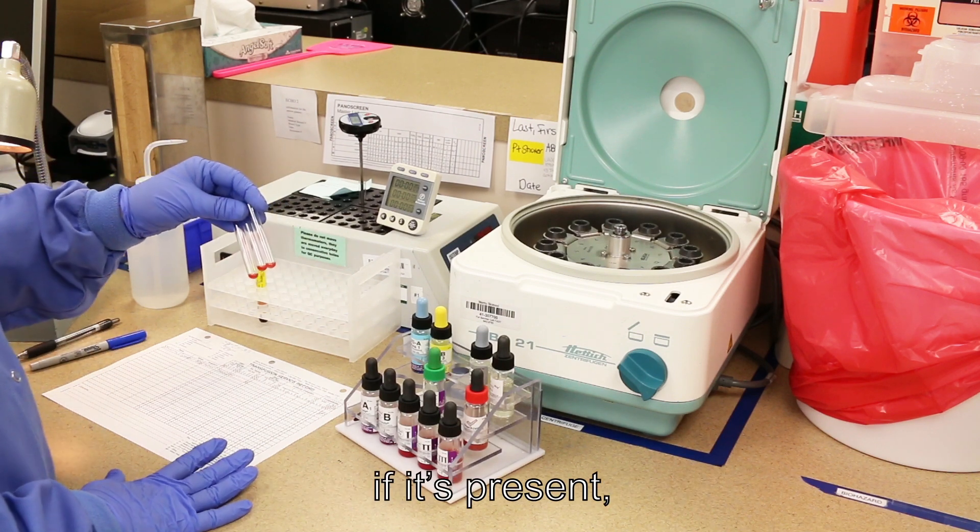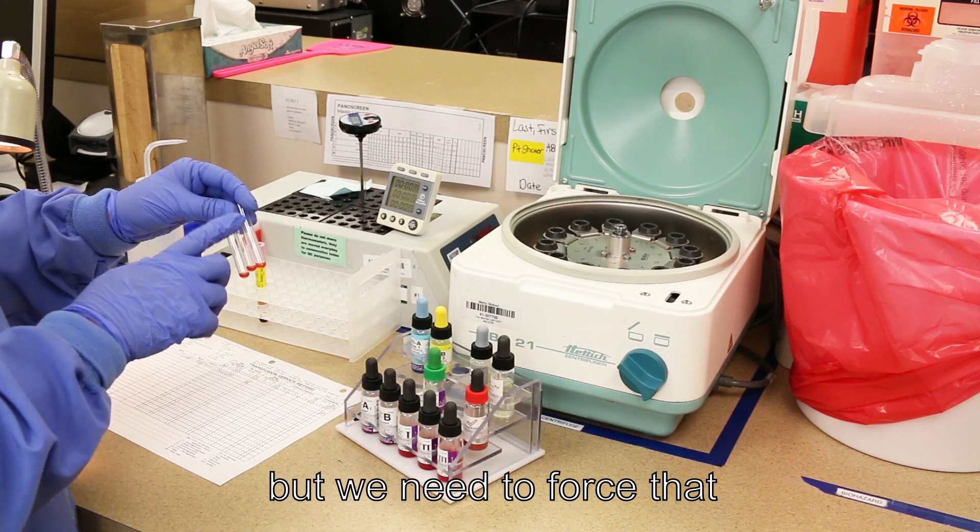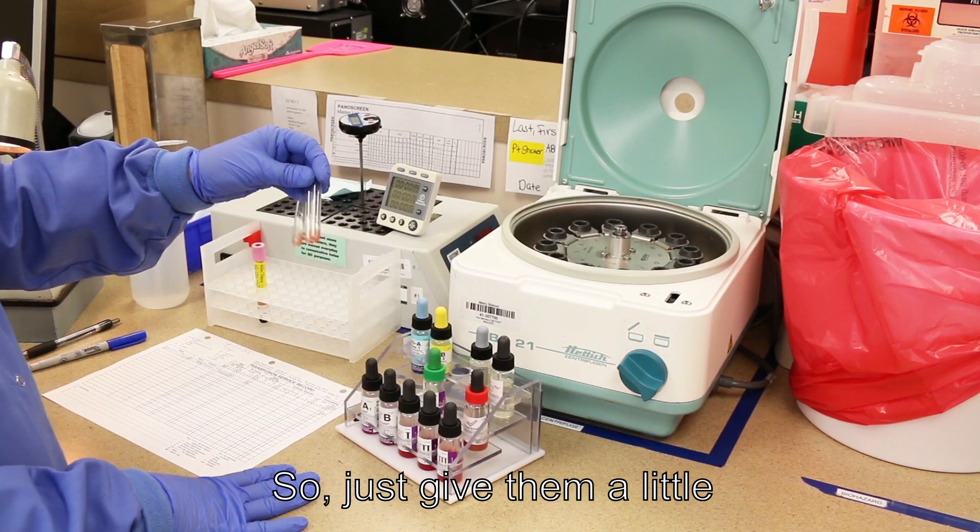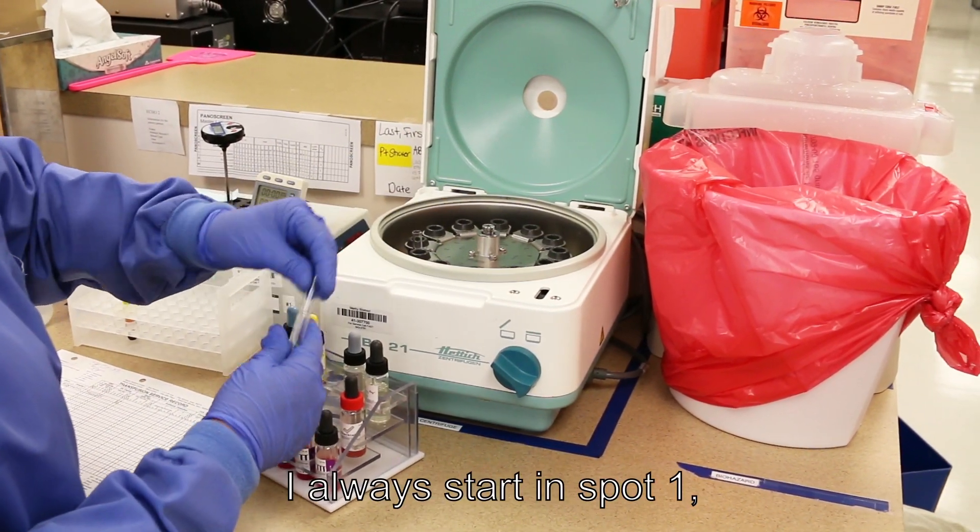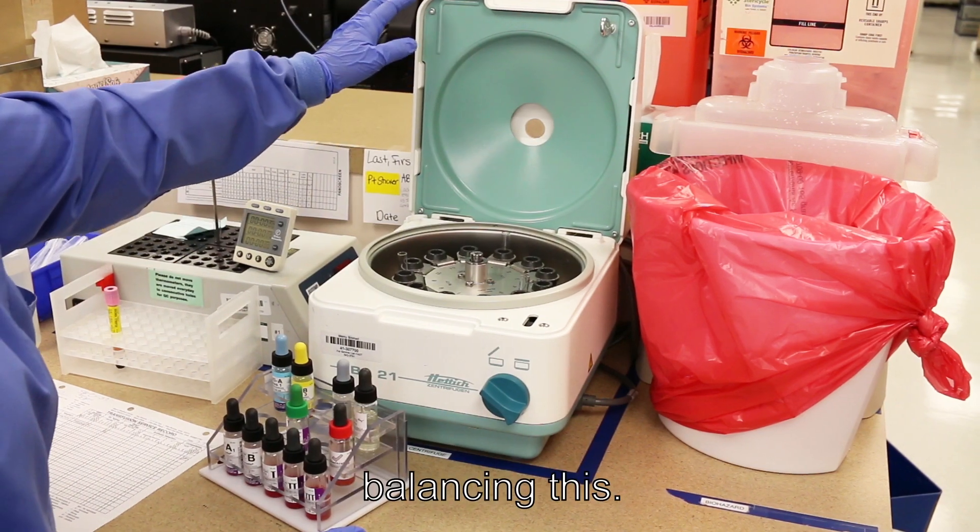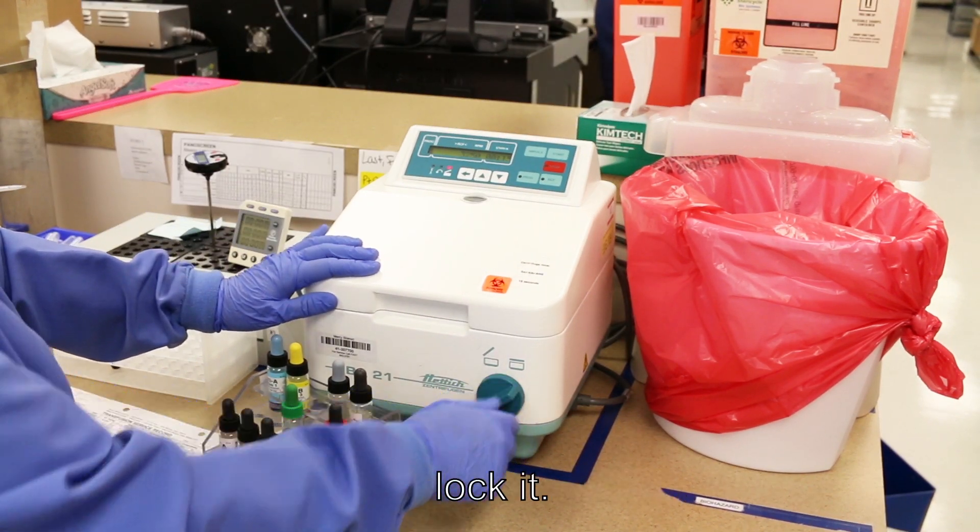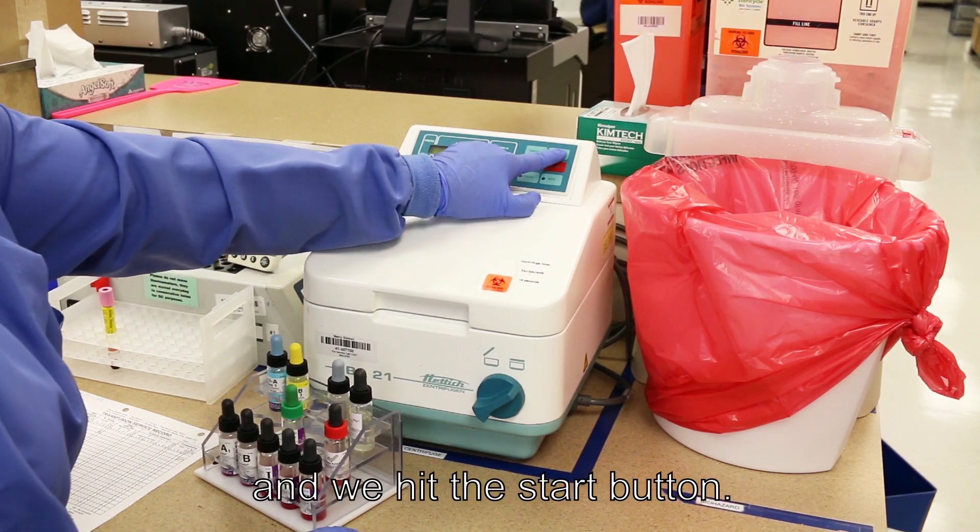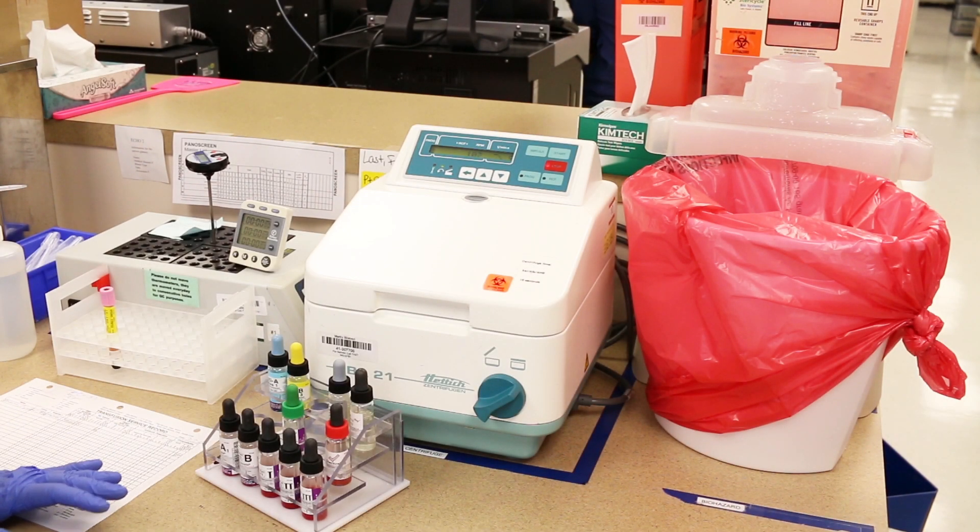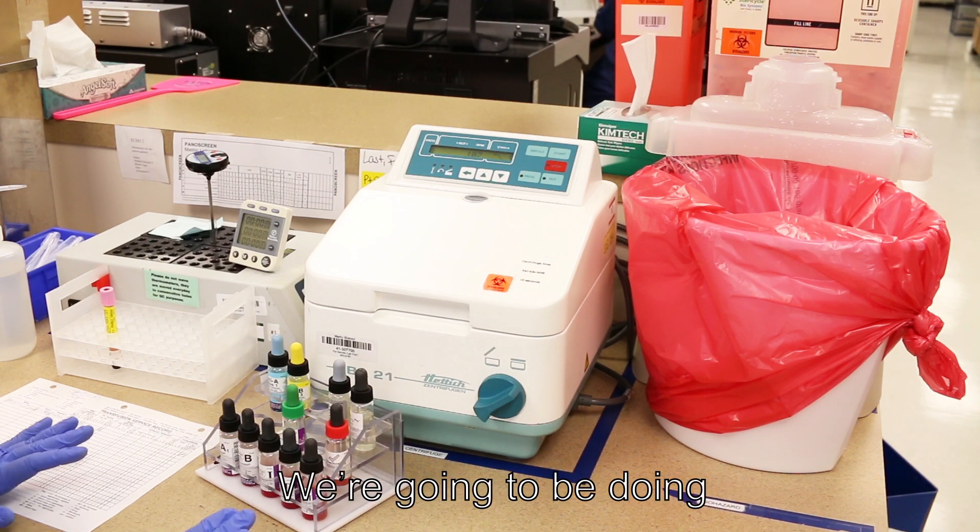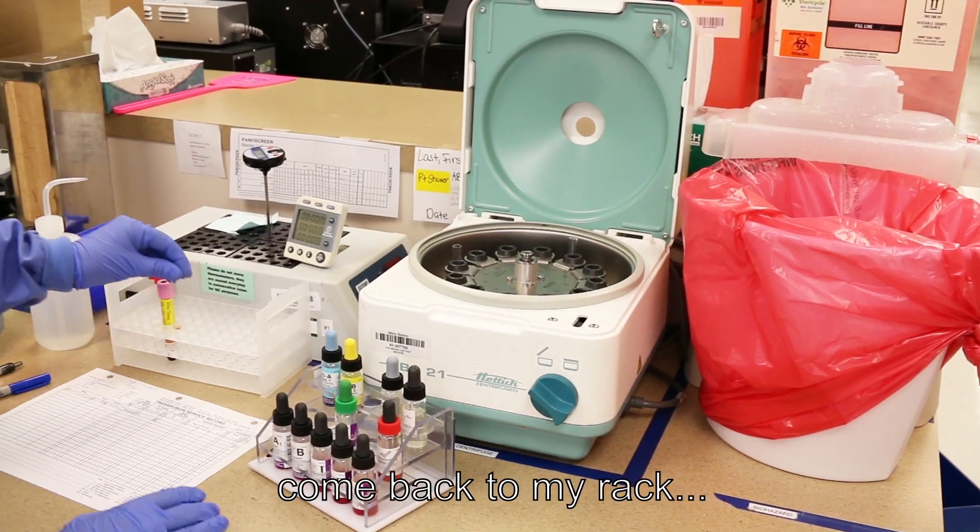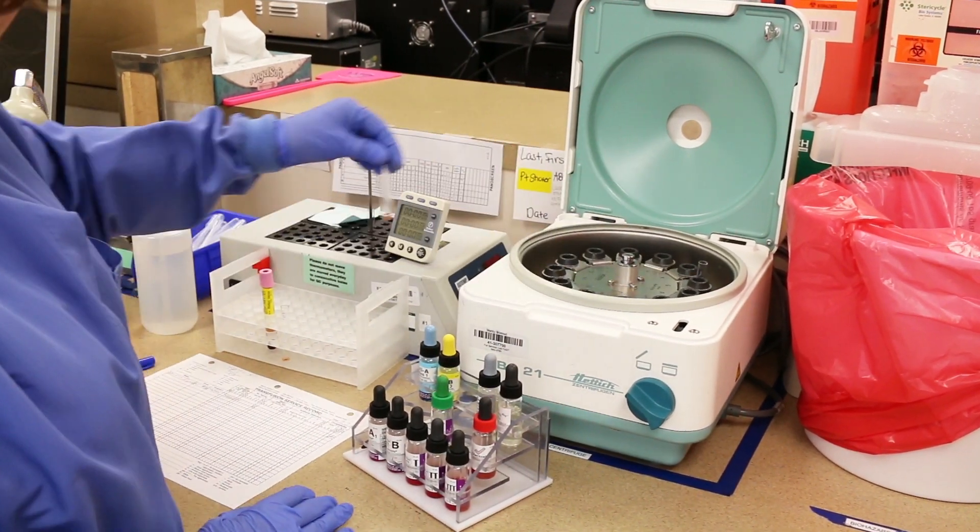So we want our antibody, if it's present, to attach to the antigen on the screening cells, but we need to force that reaction to happen, so we're going to put these tubes in the centrifuge. Just give them a little shake like this, and then we're going to start in the centrifuge. I always start in spot 1, because I like to keep things in order. And this is like a triangle, so that's how we're balancing this. Close your centrifuge, lock it. Needs to be at 3250 for 15 seconds, and we hit the start button. This stage is the immediate spin phase. We're going to be doing three phases with our antibody screen.